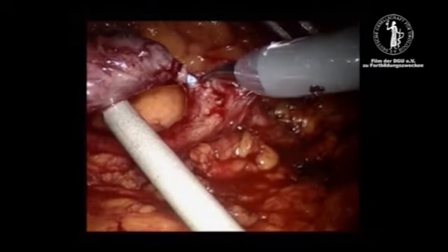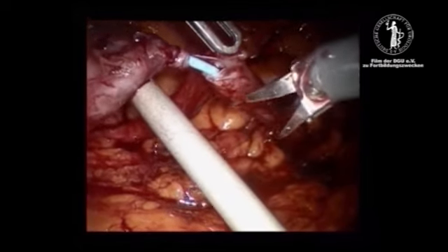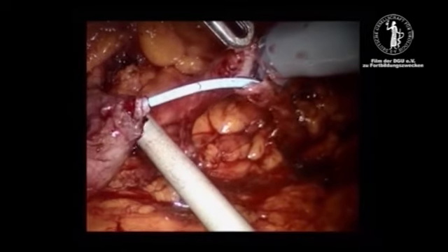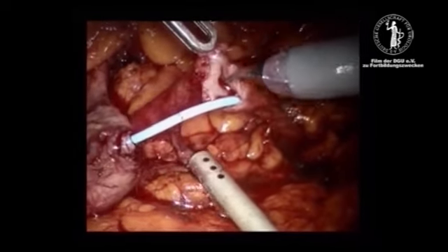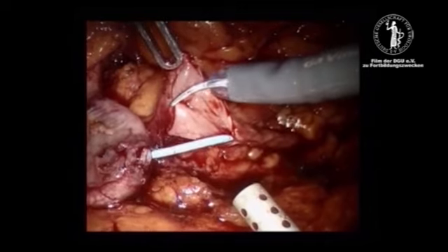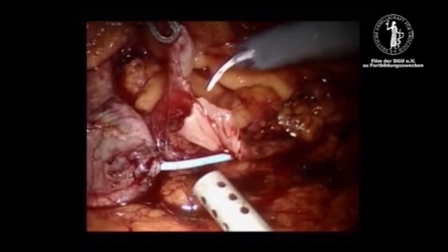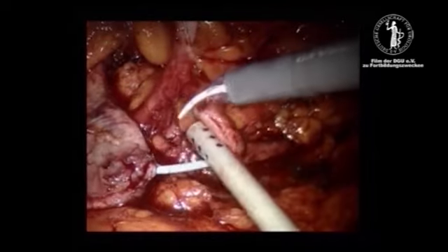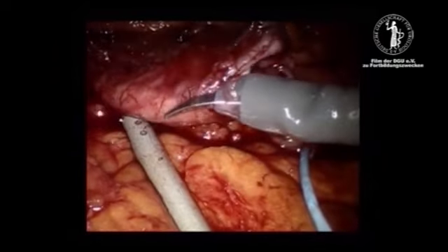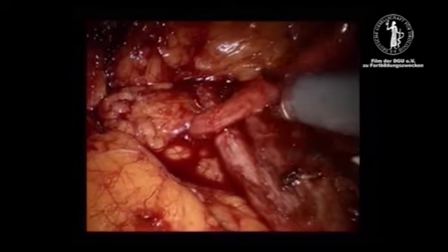Now the lower pole ureter is transected at the UPJO. The strictured segment is spatulated and partially resected. The large lower pole renal pelvis is medially incised. The resection left an approximately 5 cm pending ureteral segment.